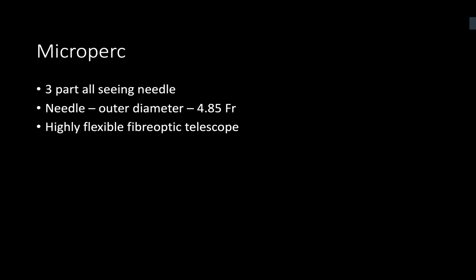Yeah, no problem. So for stones, it's very unlikely that it will go beyond a Microperc, but still, we should be aware of the options available. One is a standard PCNL, where the tract size that we mostly use with the Amplatz is 26 to 30 French. The other one, the Miniperc, we discussed, is less than 20 French.